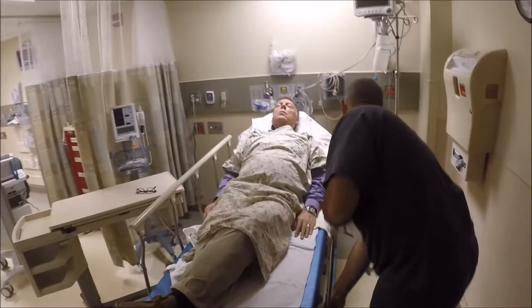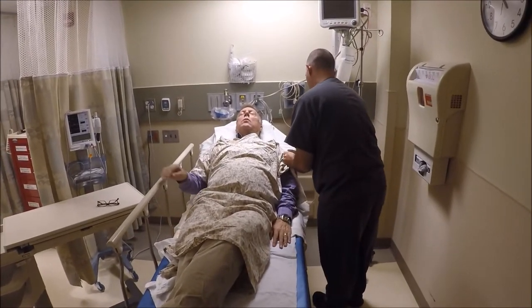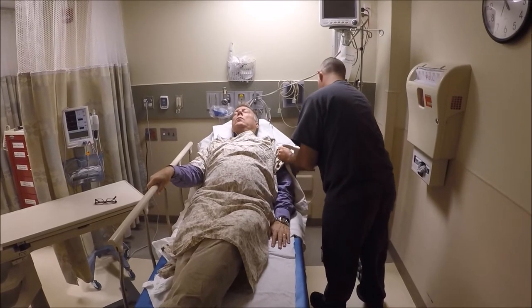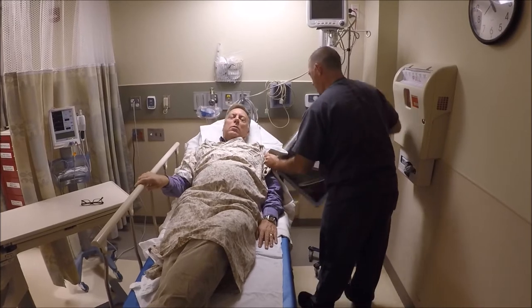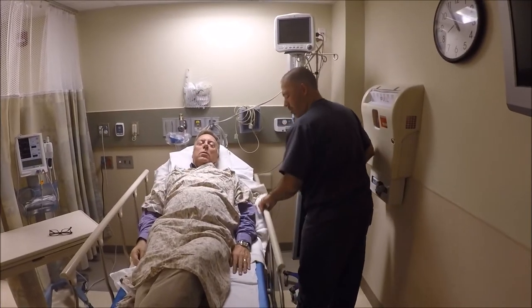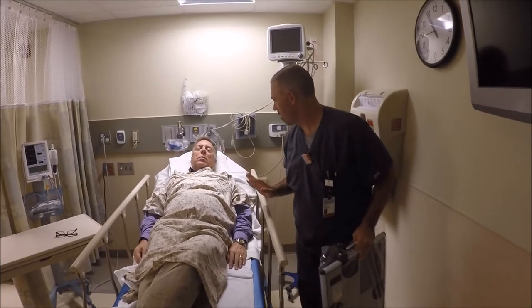Go with the rail down. Good thing is that X-ray plate comes out a lot easier than it went in. There we go. And that's it — all done. Get your rail back up here. We'll get the set out and we'll get your bed back to where you're comfortable.